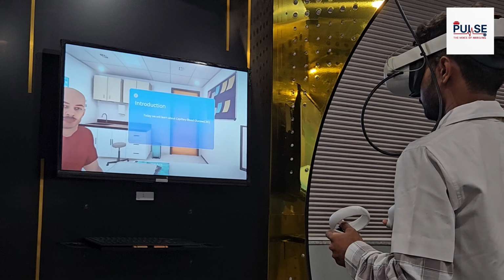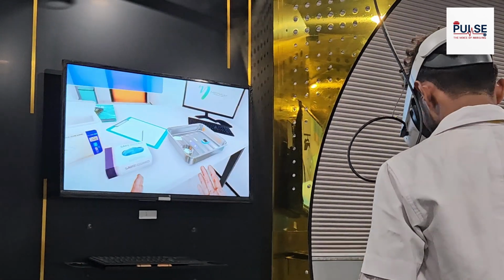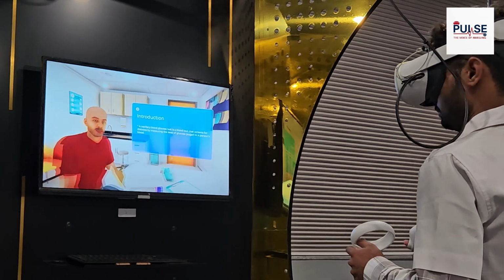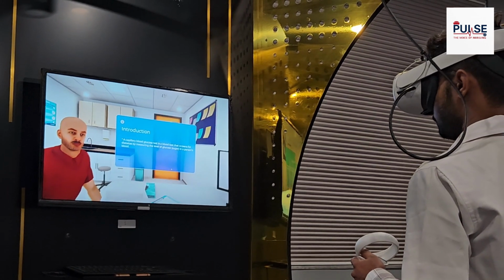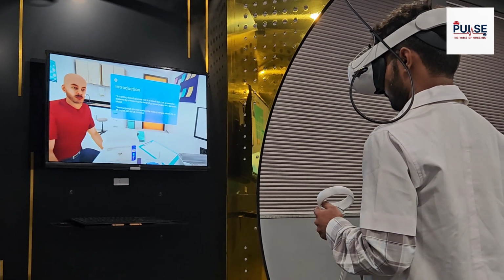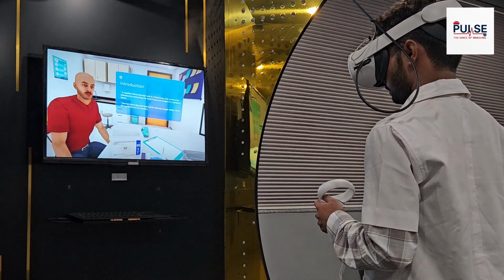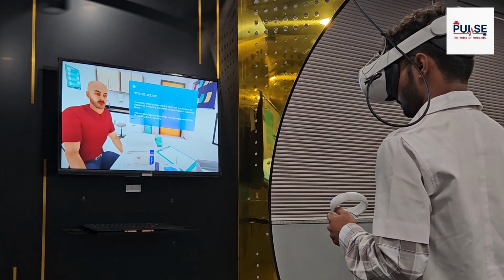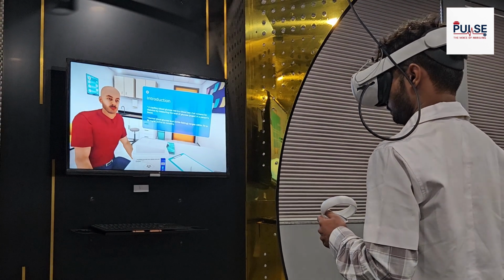Today we will learn about capillary blood glucose. A capillary blood glucose test is a blood test that screens for diabetes by measuring the level of glucose in a person's blood. Normal blood glucose level, while fasting, ranges within 70 to 99 milligrams/dl, 3.9 to 5.5 millimoles/L in adults.